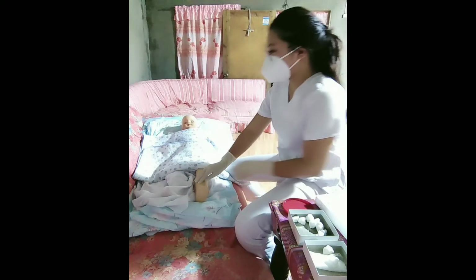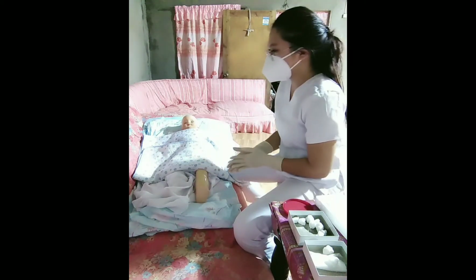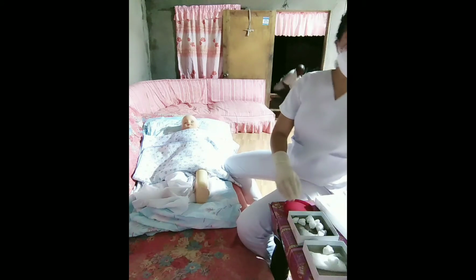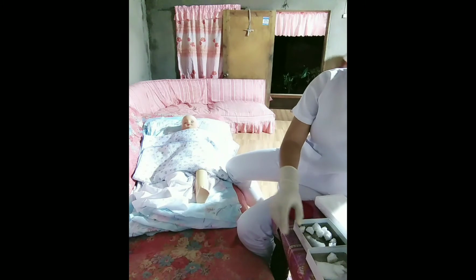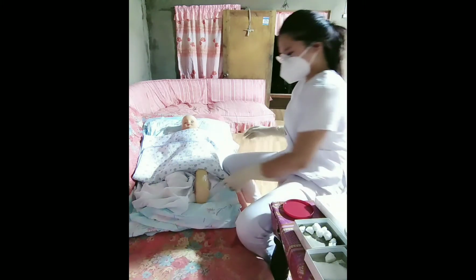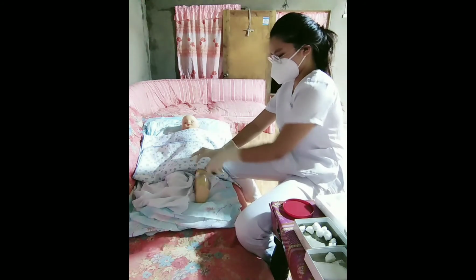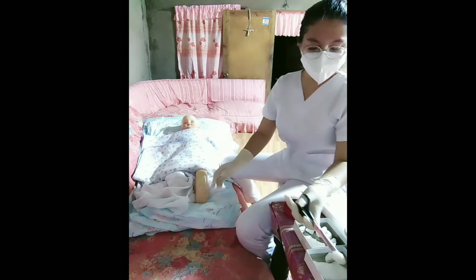So the next step is to apply dry sterile gauze to the incision or wound. Then place the used items in the waste receptacle.